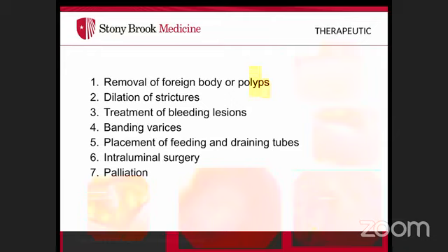Passing through the upper esophageal sphincter requires insufflation and slight pressure — this is typically the hardest part. Once in the esophagus, use gentle insufflation while examining the mucosa as you advance. At the GE junction, measure the distance from the teeth. The landmark is the top of the gastric folds where the esophagus transitions to the stomach.